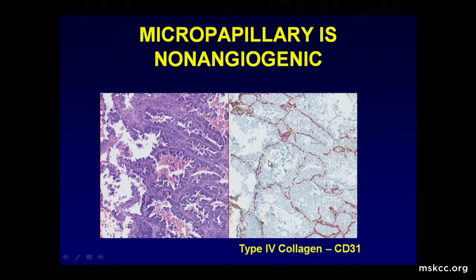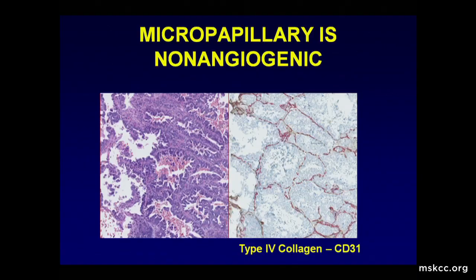The other thing that just really blew me away, because I never do CD31 on lung adenocarcinomas, but here's a CD31 we investigated. I thought there would be sprouting of vessels into the STAS clusters, or you would see some breaking of the endothelium in the alveolar walls, but here you're looking in the main tumor. There's not a single blood vessel, and you know, we define it as a papillary cluster lacking a fibrovascular core. So it kind of makes sense that there would be no blood vessels in it.